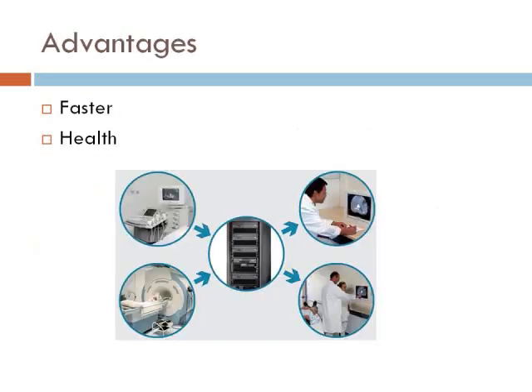There are a few advantages of the PACS system. I'm just going to mention a few of them. One is that it's definitely faster and quicker. It allows faster access to the X-ray images, for instance, and as soon as it's uploaded to the system, the doctor that ordered it can get it.